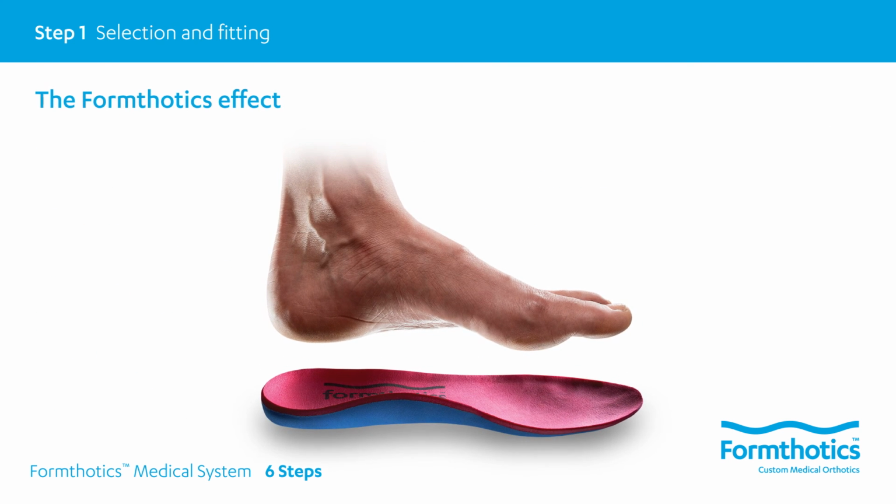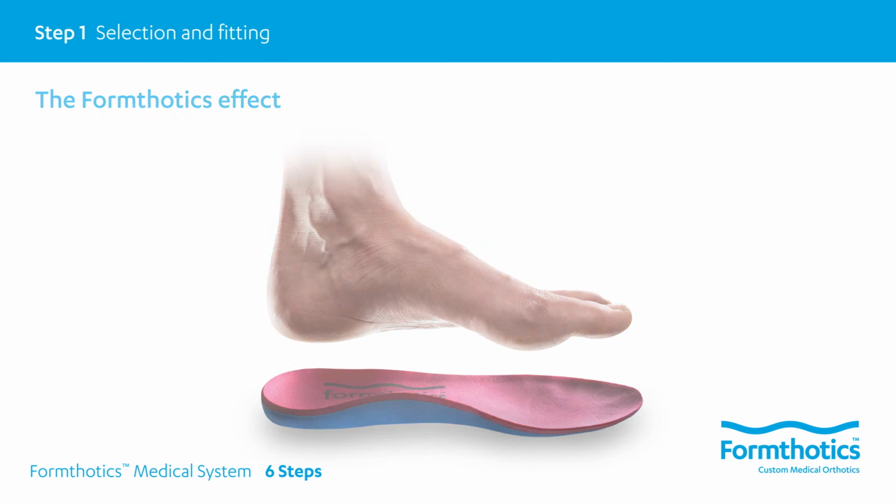Formthotics provide a total contact to the bottom surface of the foot, providing exceptional comfort and optimal biomechanical support. Formthotics deliver on the mechanical theory by applying pressure to the sole of the foot, altering the posture and movement of the subtalar and other joints. This changes the posture and mechanical function of higher structures in the body.